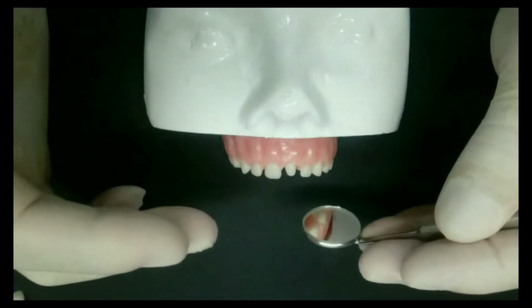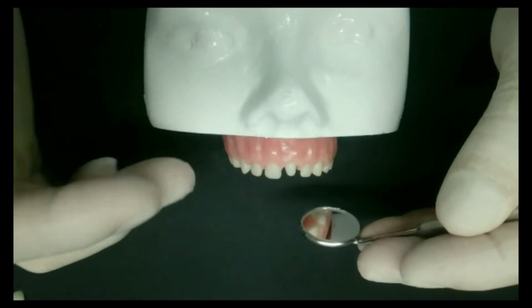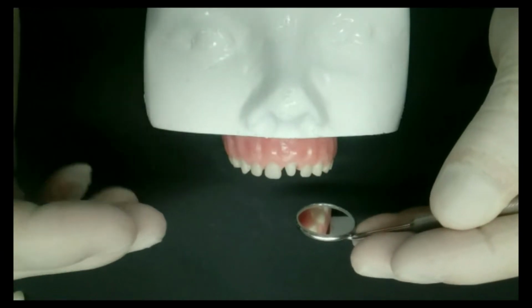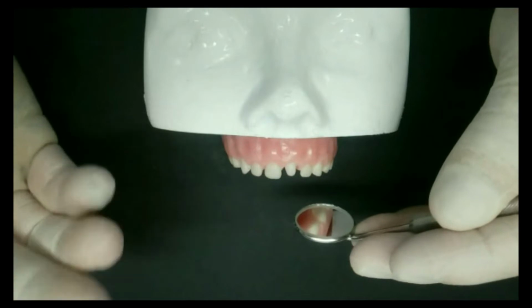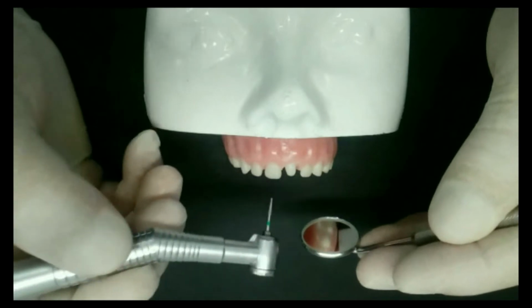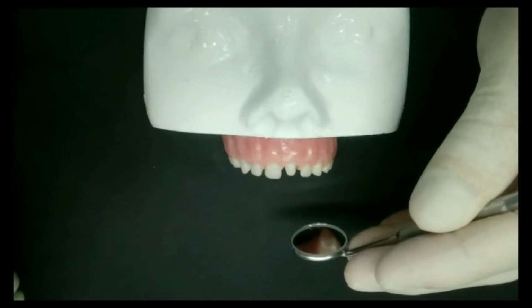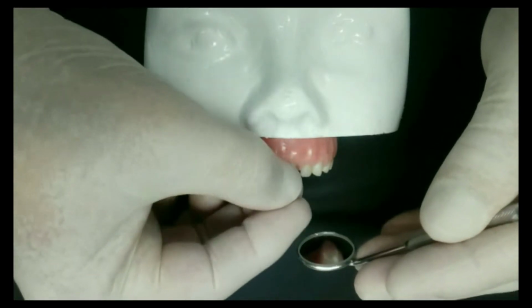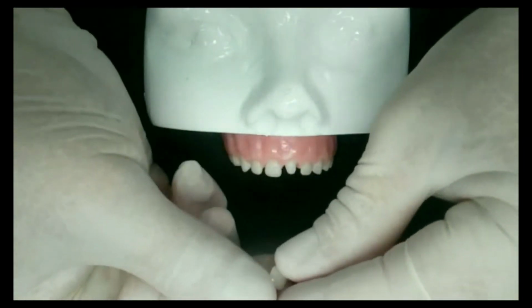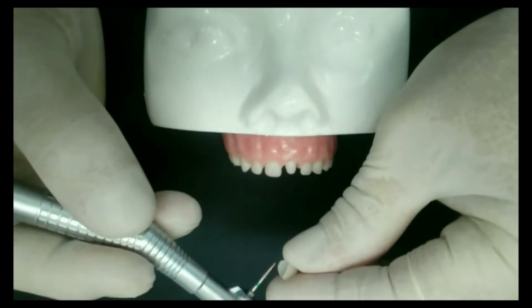In the clinical phase, the cementing technique of the resin crowns made with the ZR system is very similar to that of zirconia crowns. Any dentistry student will be able to execute it without problem, and for an experienced dentist, the technique will be extremely simple. First, the cavity is completely eliminated and the stump is prepared in a conventional way. We proceed to test our crown, and if necessary, we cut the surplus required to adjust its height and verify that it fits loosely on the stump.